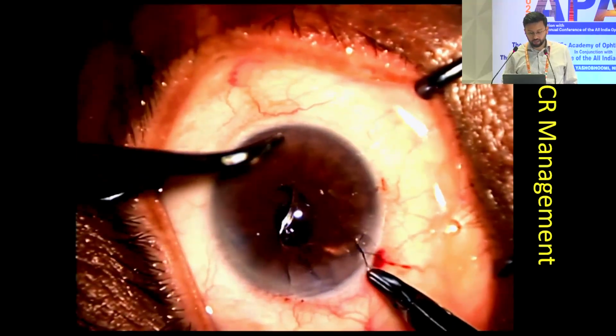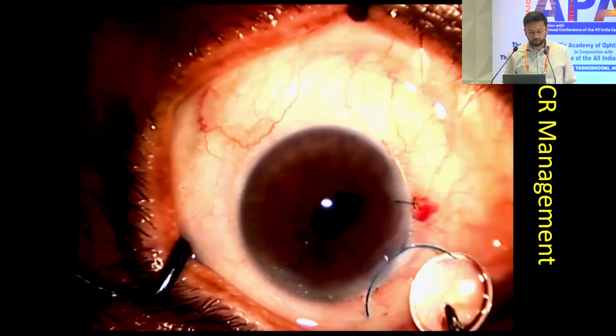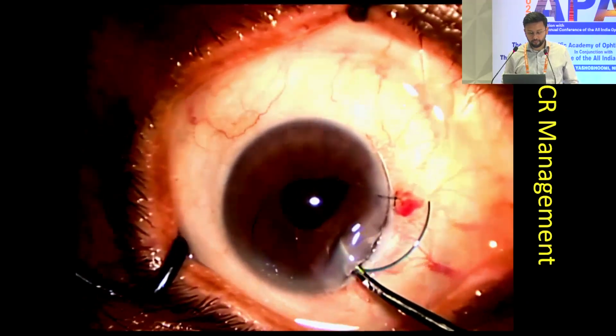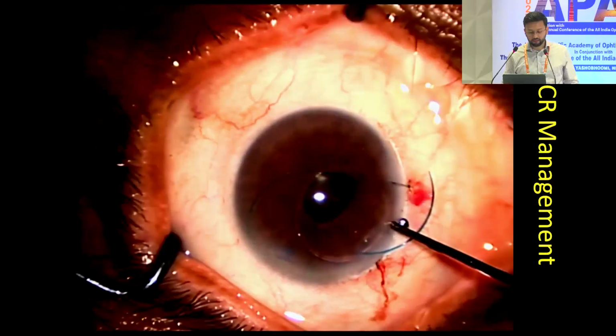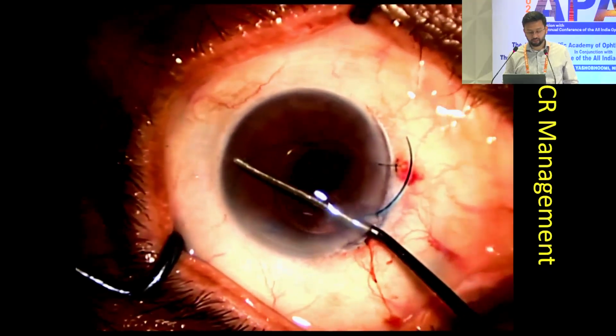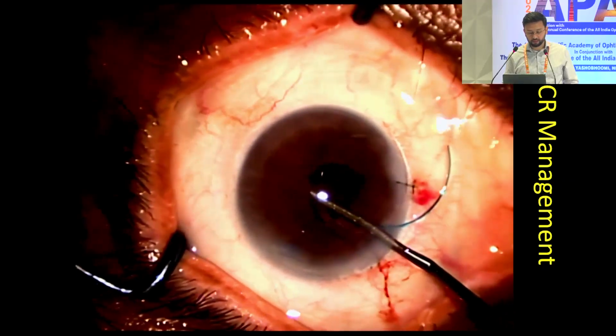following which we started anterior vitrectomy, ensured there are no vitreous strands in the AC. And then we implanted a 3-piece IOL. Here, because there was good anterior capsular support, we are attempting to implant it into the sulcus.